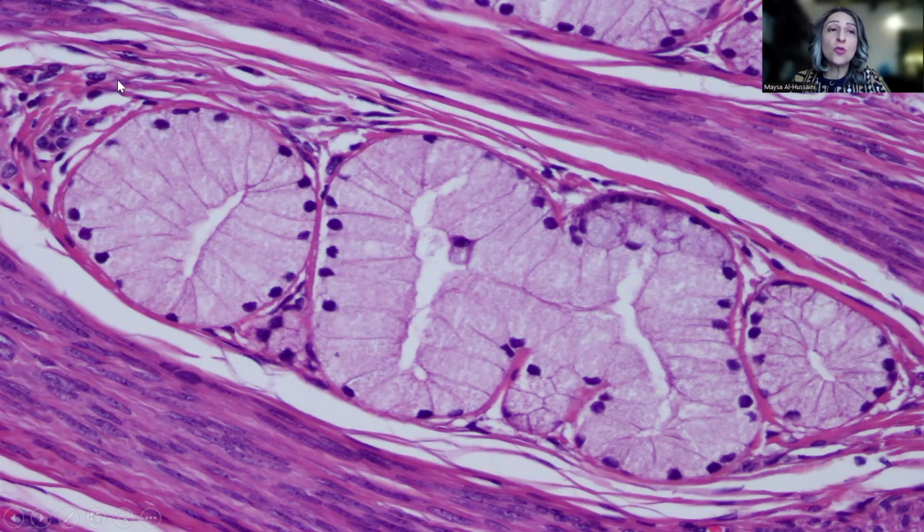Importantly, when these tumors invade, they invade with minimal or no desmoplasia, and this is where the trick becomes extremely important: to recognize these as tumor glands, a tumorous growth, because the lack of desmoplasia might be tricky, and some people might not pay attention to the extreme invasiveness of the tumor going deep into the wall because of the lack of desmoplasia.